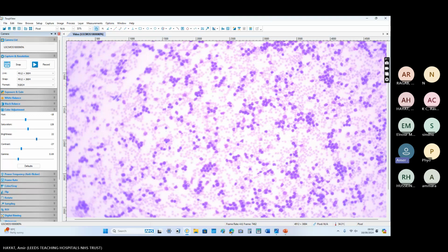The CT scan in the emergency department shows intracranial hemorrhage. The biomedical scientist noticed that the platelet count is very low, it is 94. The white cell count is very high, it is 960, and the hemoglobin is 102. He thinks that this film is consistent with chronic myeloid leukemia.